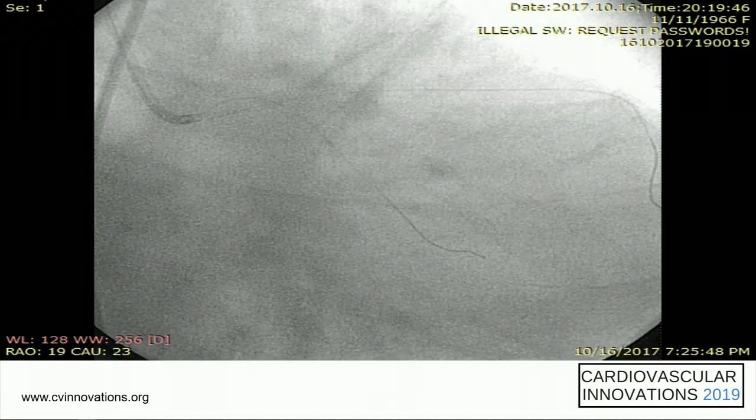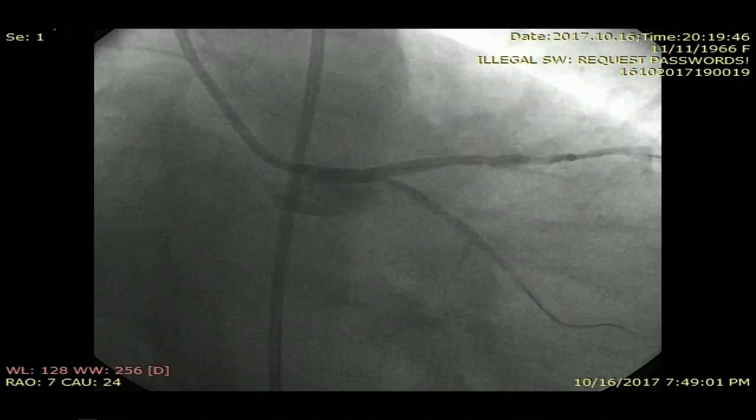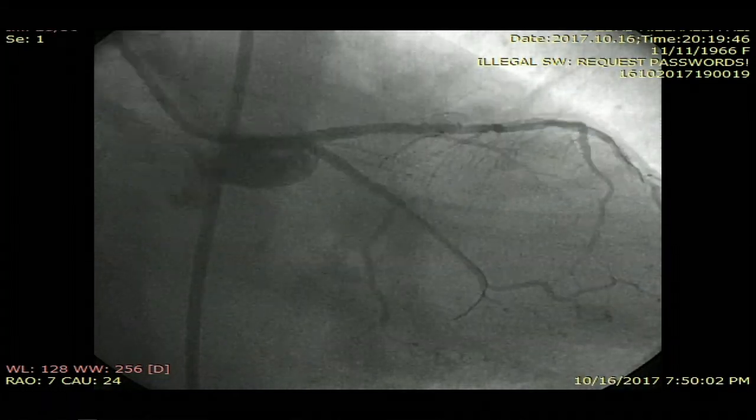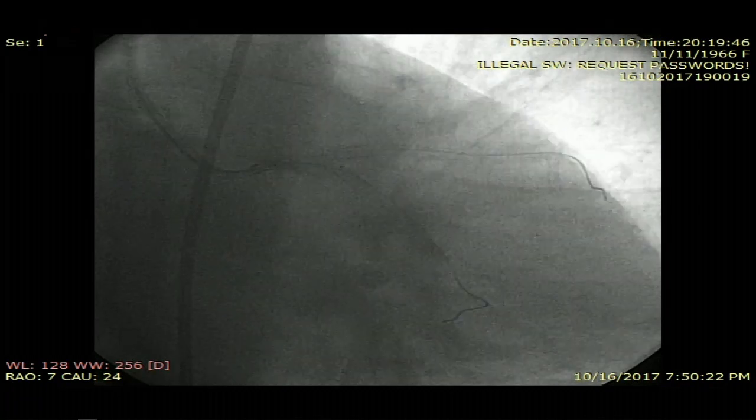We flared the ostium of the LAD stent. And then we passed the balloon to dilate the ostium of the CIRC and the struts of the stent. Then we put in the second stent. After optimizing it, we deployed it, and this result was good, and only the step of kissing balloons remained.